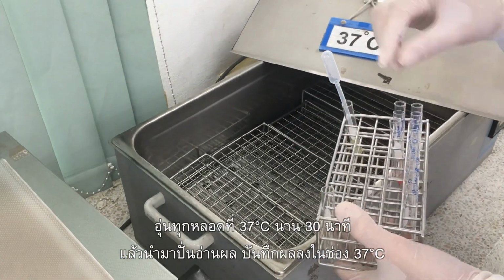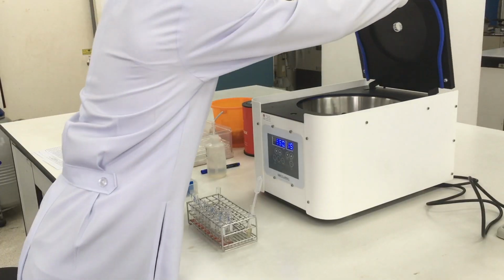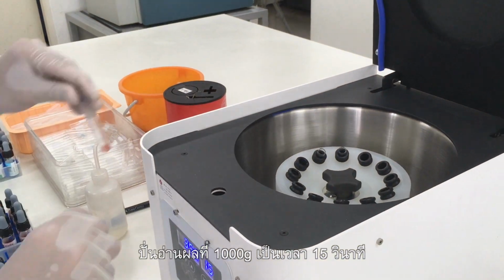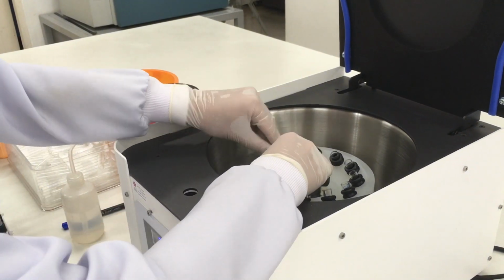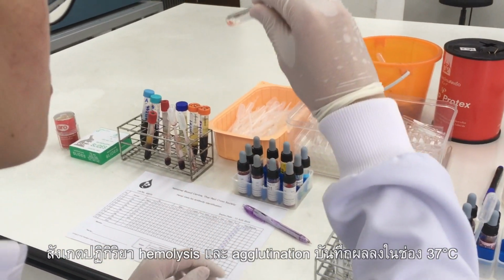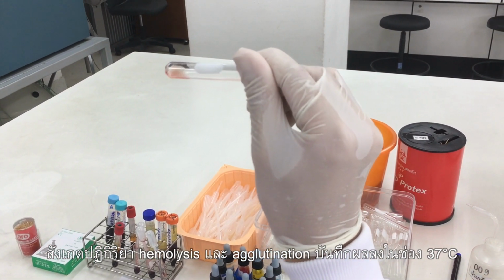Incubate all tubes at 37 degrees Celsius for 30 minutes. After completion, centrifuge at 1000 G for 15 seconds. Observe for hemolysis or agglutination and record in the 37 degrees Celsius phase.